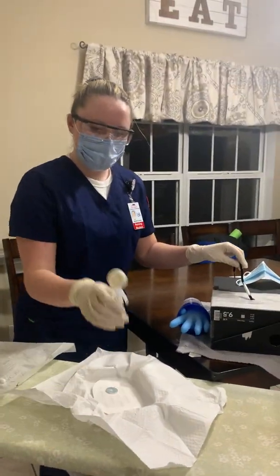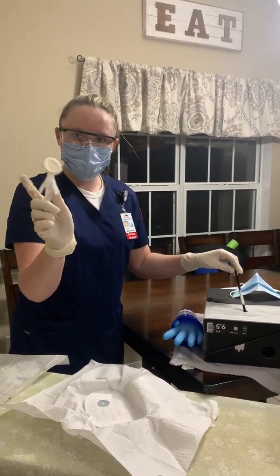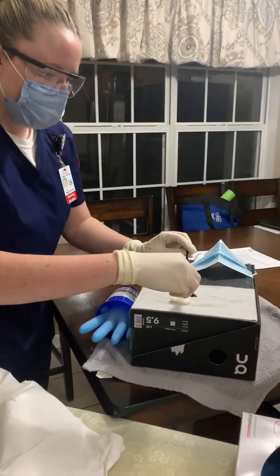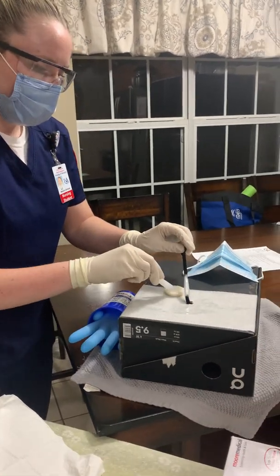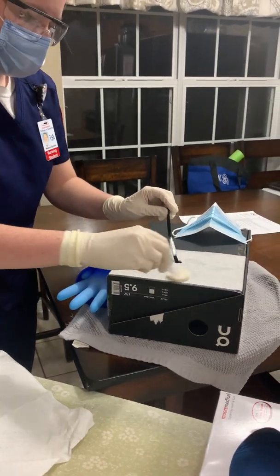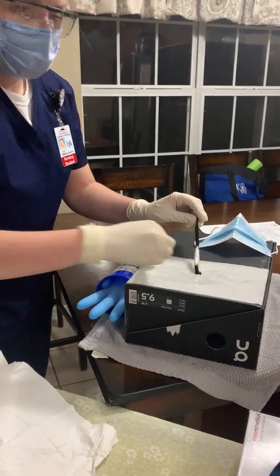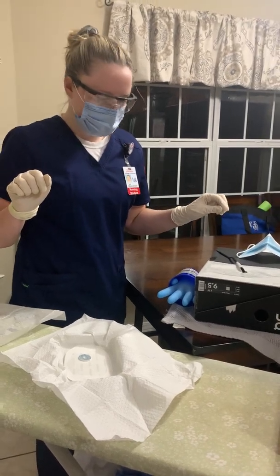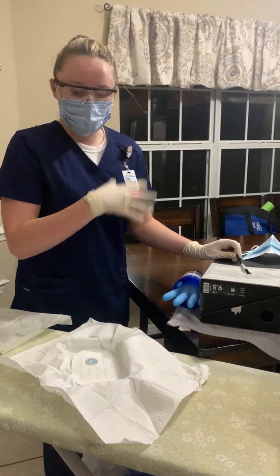Okay, so now that I've done that, I can use my chlorhexidine cleanser. I would normally pop this and it would make a popping noise and soak the sponge. And I'm going to do it in vertical motions as well as horizontal and circular, getting underneath the hub and underneath the catheter, making sure to scrub all over the skin. I would do this for 30 seconds. And then after that, I would let it dry, being careful not to touch it until it's dry.